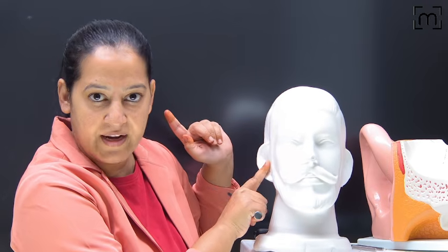Okay. So what we will do here in Weber test, we compare BC of both the ears. In Rinne's test, we compare AC and BC of one ear. In Weber test, we compare BC of both the ears.